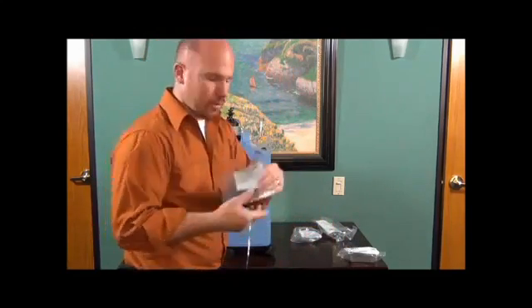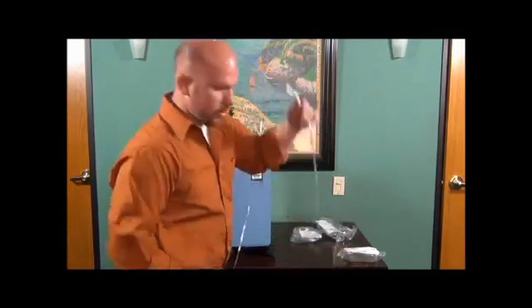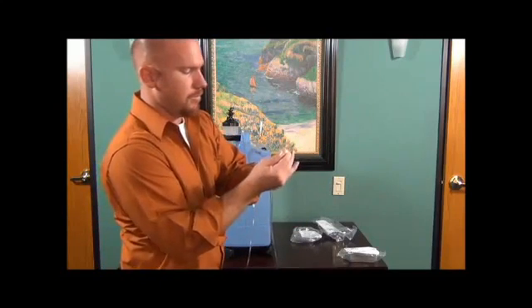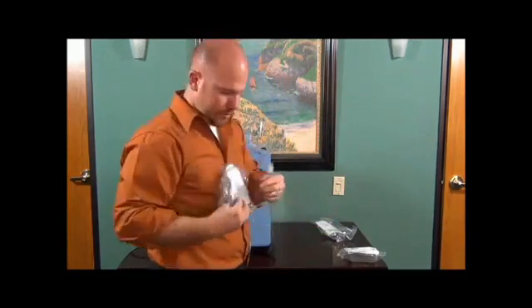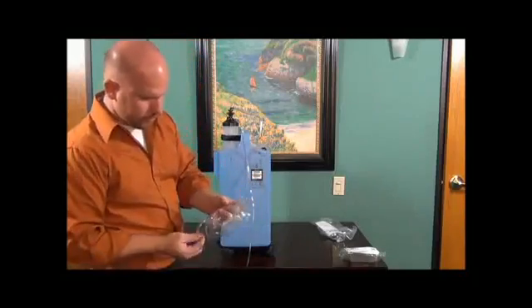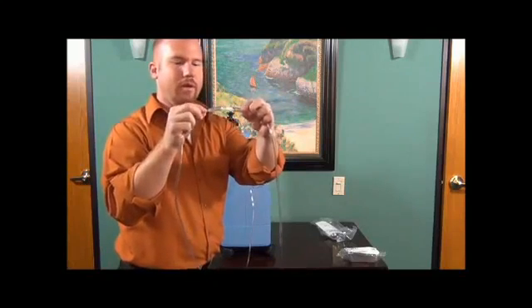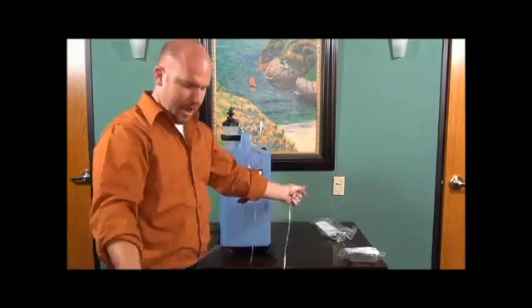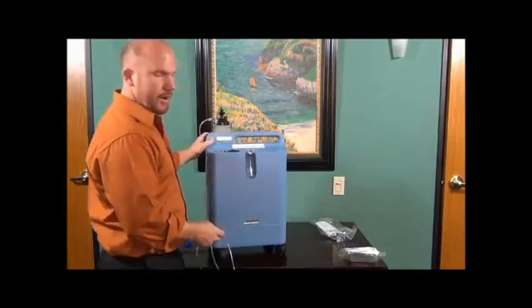You take your connector swivel. That goes right here at the very other end of your 25 or 50-foot tubing, just like so. Then you take your cannula or your nose piece, and that goes on the very other end of your swivel, which connects both of those together. And now you have humidified oxygen as it comes from your humidifier bottle.